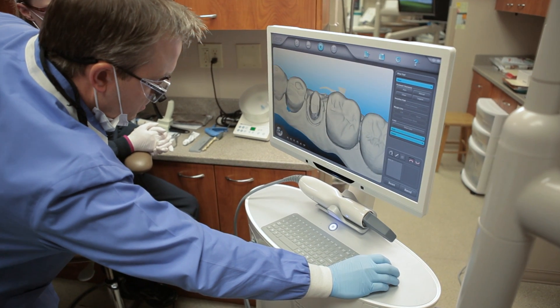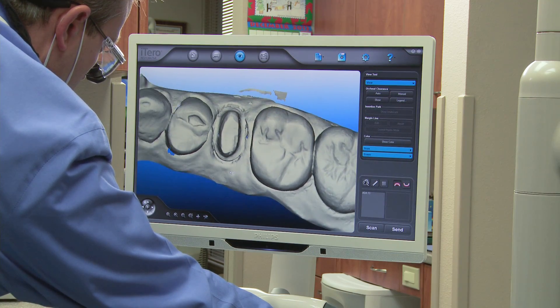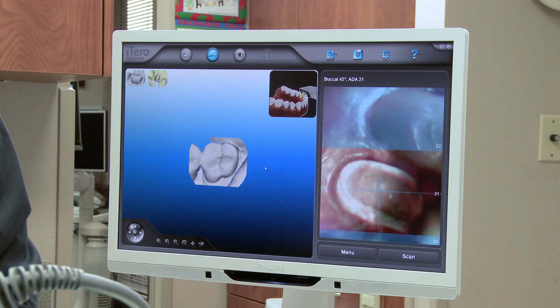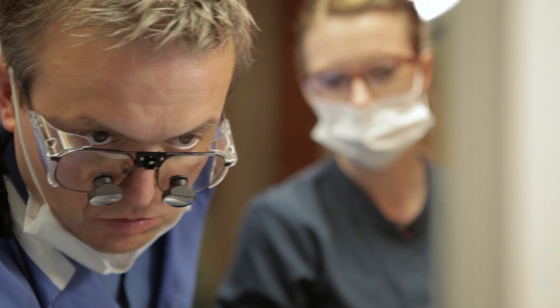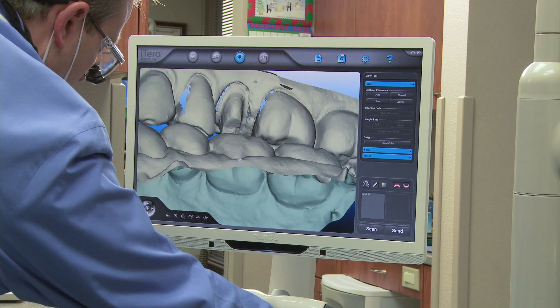Scans are modeled in real-time, and any needed adjustments to the scan are addressed easily with iTero restorative software, like the eraser tool, before the patient leaves the chair. When the doctor is satisfied, the scan is sent to Align for validation, and then sent along to the lab for restoration fabrication.